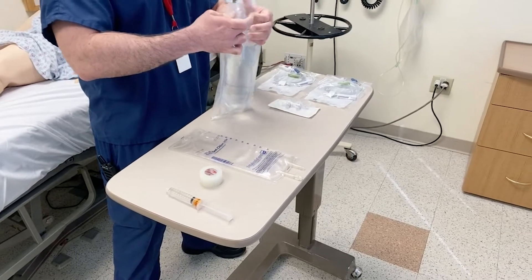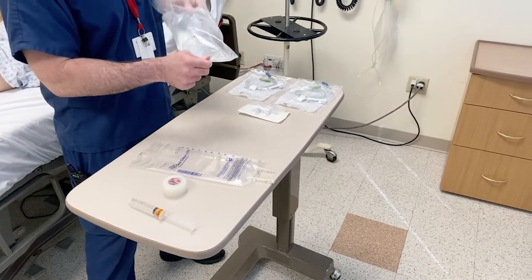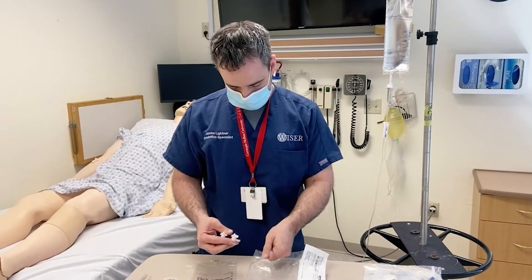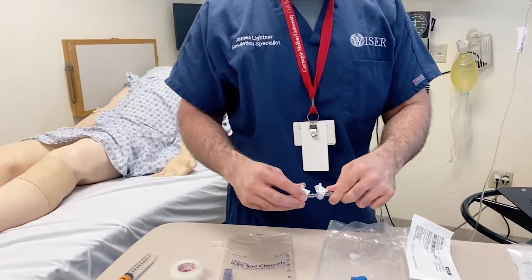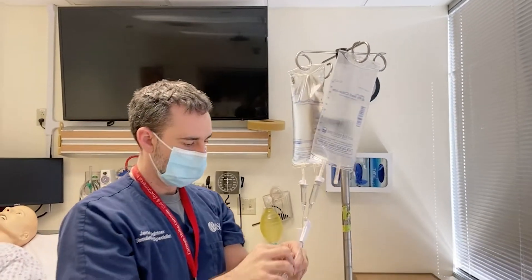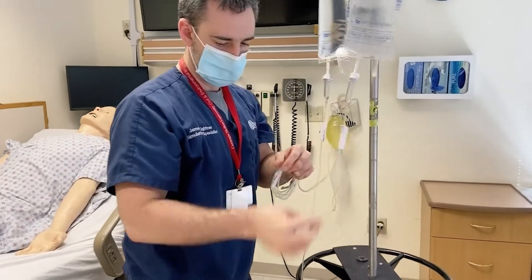First, hang your full fluid bag and connect your first IV drip set to the full bag. Next, grab your stopcock and connect the drip set from your full fluids to the entry point on the stopcock. Now let's hang your empty fluid bag and connect your second IV drip set, same as you did earlier, running that line to the opposite side of your stopcock.